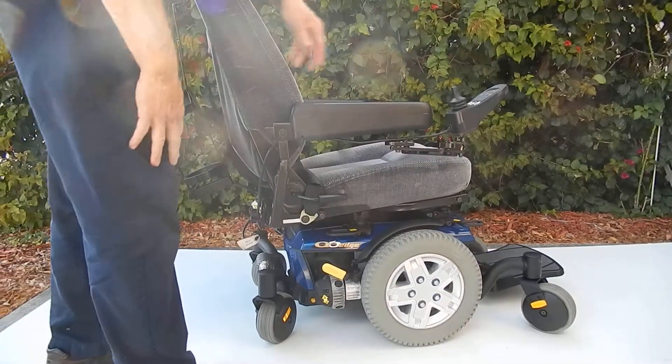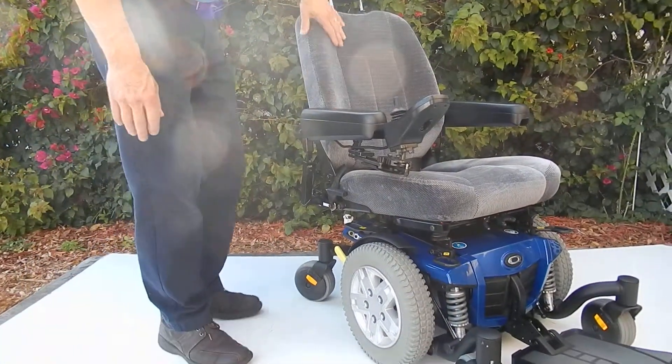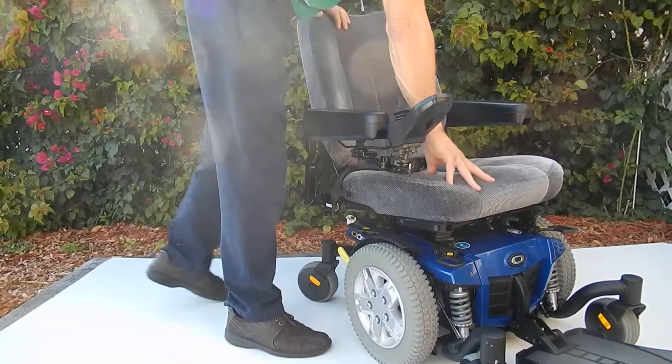This chair has an adjustable seat. The seat is a cloth seat, 20 by 20, and it's adjustable forward and back. Very plush.